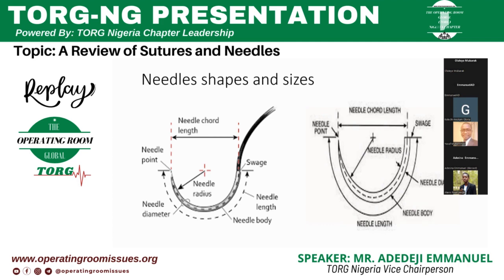We have different types of needle. We have the taper, we have the cutting. You can see the parts of the needle demonstrated here. We have the needle point, the needle radius, and the diameter.